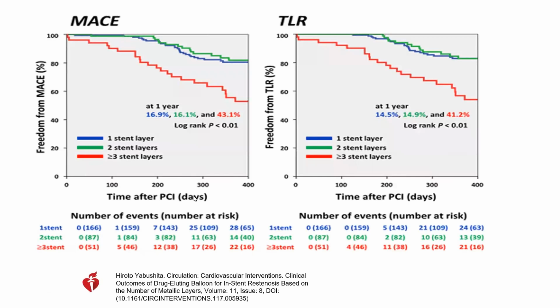We don't have, I couldn't find, data about the long-term outcome of putting a 3rd stent, which I try to never do. However, we know that if you have a 3rd stent and you get restenosis of that 3rd stent, doing DCB on a 3rd layer of stent is associated with very poor outcome.